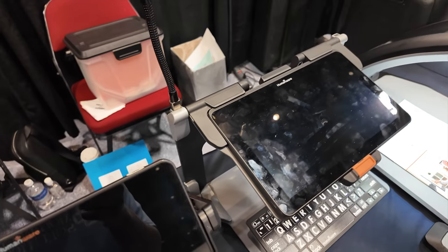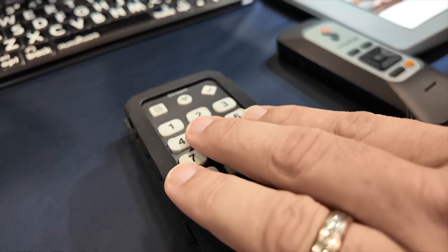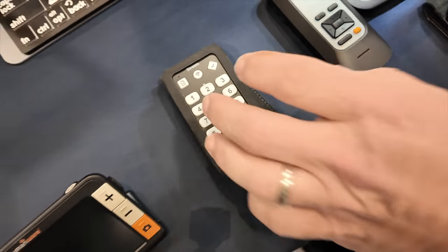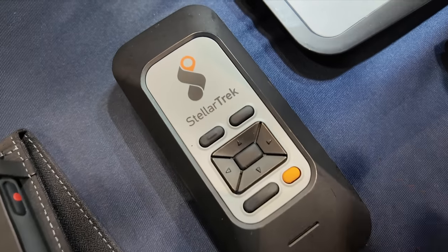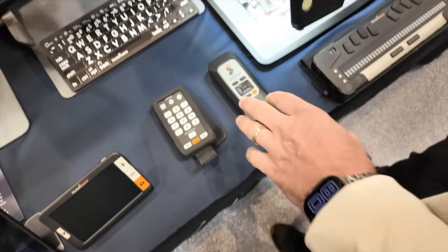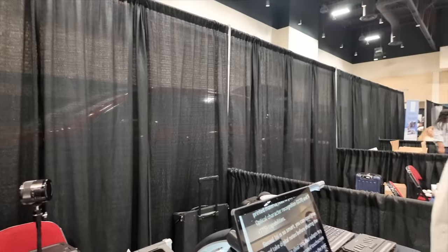And then you have two small devices. This is called the Victor Reader Stream. It's like an iPod for the blind. You can read books, listen to music, or download books on the storage card. And this is a GPS for Atlanta. It tells you where you are, what's coming up, what's on your left, what's on your right, and how to get to point B if you want to. For example, if you're on the bus and you want to know where you are, you don't just rely on the bus driver. He's got a bus to drive.